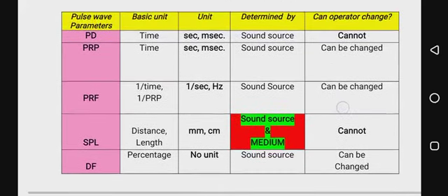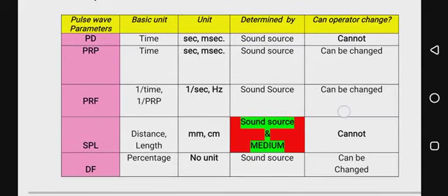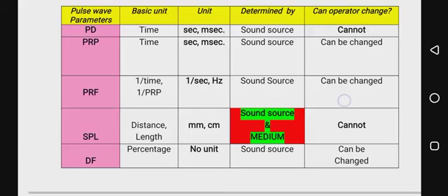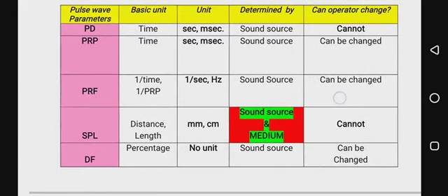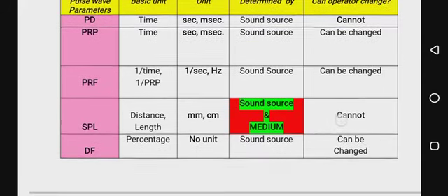Duty factor is unitless and is in percentage. It is determined by sound source only and can be changed by the operator.